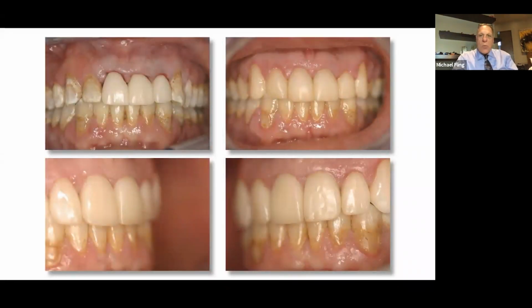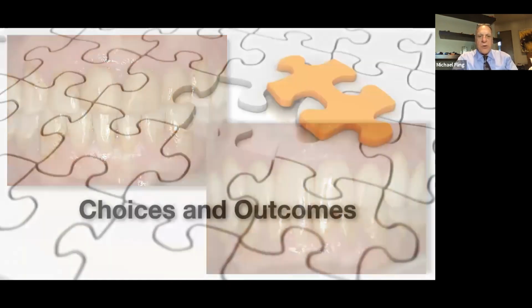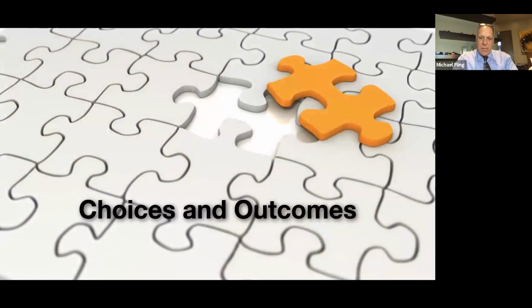And you'll see that we start to adapt that through the techniques that we're going to look at to get in place. And then we start to adjust and to contour and to polish. And it's utilizing these techniques that we can get some dramatic changes with soft tissue. We can verify aesthetics before we transition to permanent restorations.